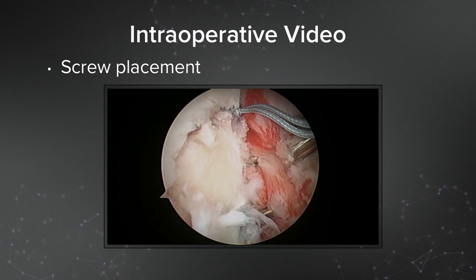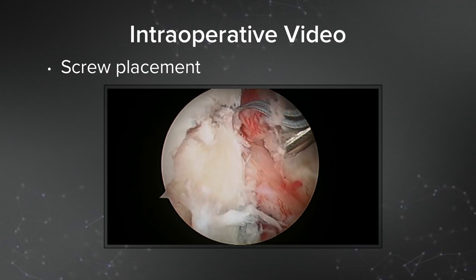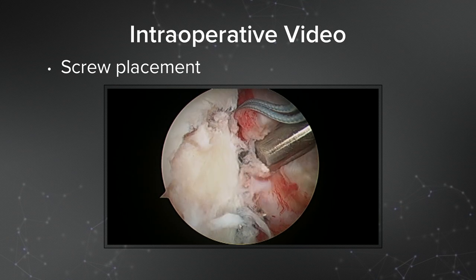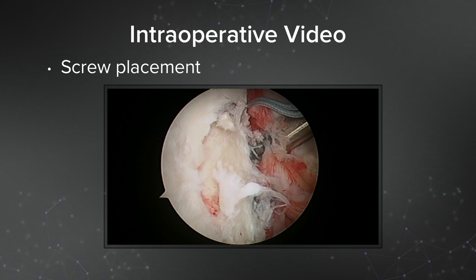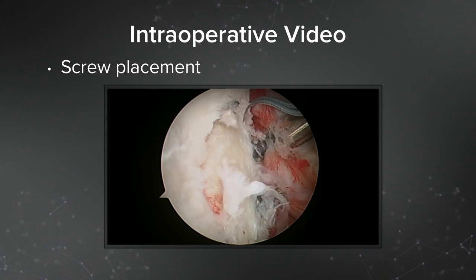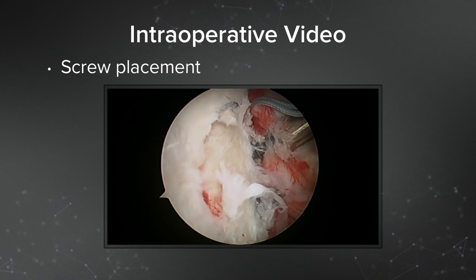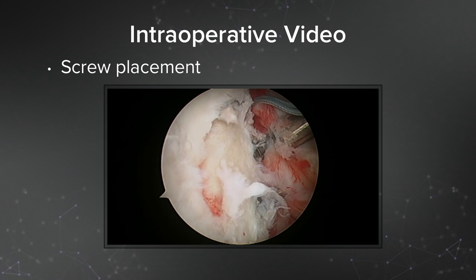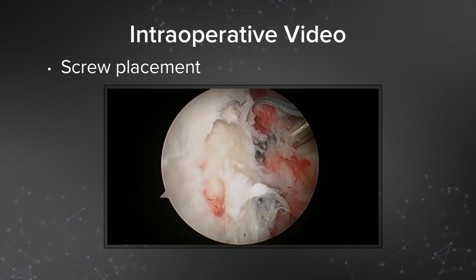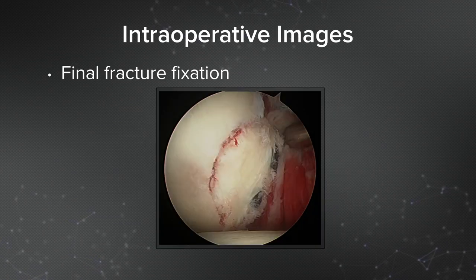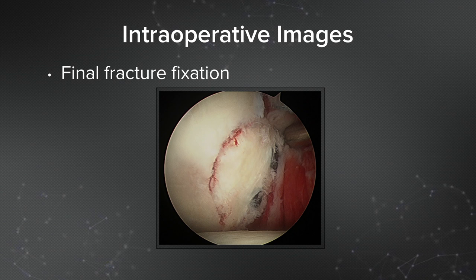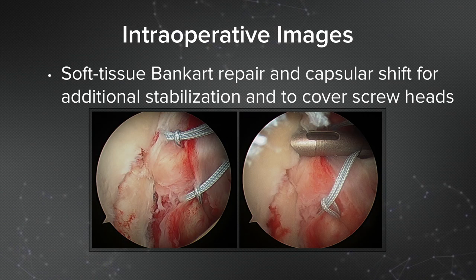Here is video of actual screw placement. I've retracted the soft tissue with the freer elevator, then I'm coming in by hand and gently placing the cannulated screw, which is a 3.75 cannulated screw. I've left the other pin in place while doing this so as not to disrupt the fracture. Here is a picture of the final fracture fixation — you can see this is an anatomic reduction, the screw heads are slightly countersunk. Then I perform a soft tissue Bankart repair and a capsule shift for additional stabilization to cover the screw heads.